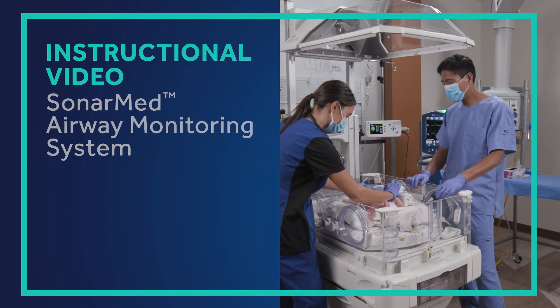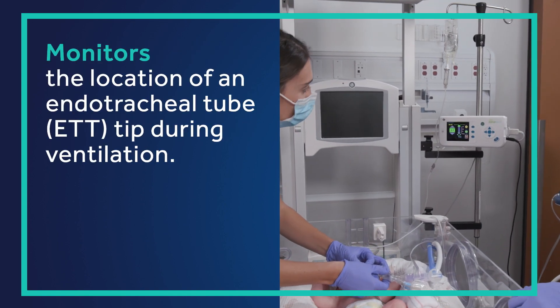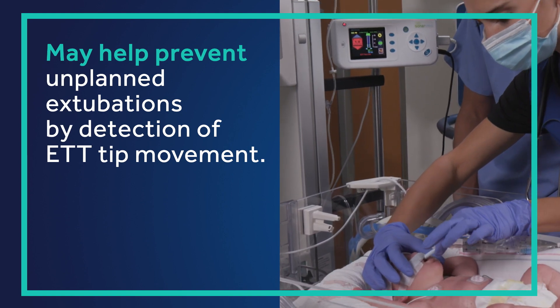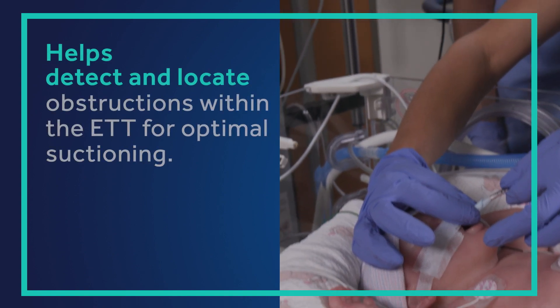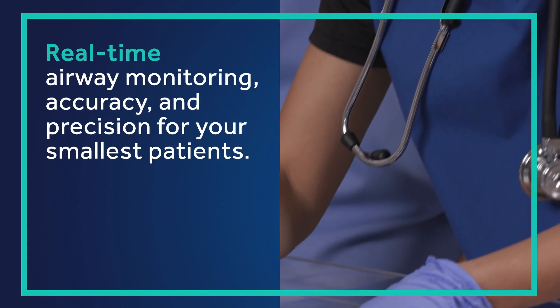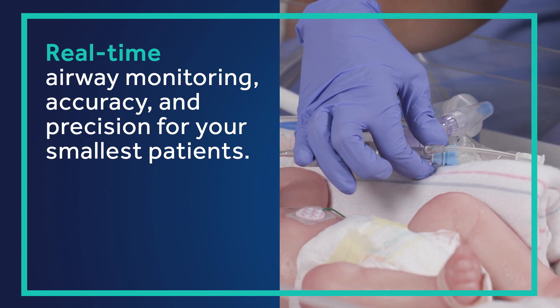Welcome to our Medtronic SonarMed Airway Monitoring System instructional video. This first-of-its-kind device will help in monitoring the location of the endotracheal tube tip during ventilation and may help prevent unplanned extubations by providing notification of tube tip movement. The device will help detect and locate obstructions within the ETT for optimal suctioning, helping improve the ability to manage your patient's airway at the bedside. It can be used on all endotracheal tube sizes and all patient sizes from neonates to adults.